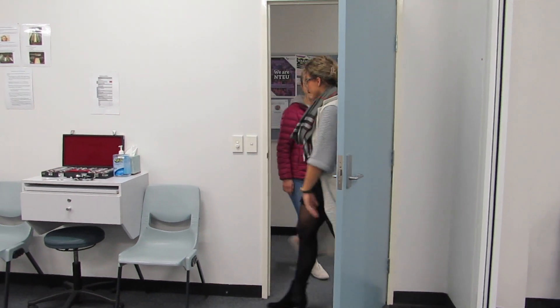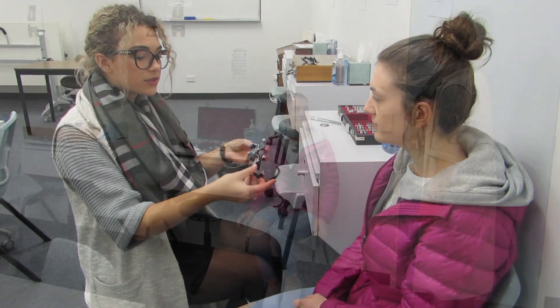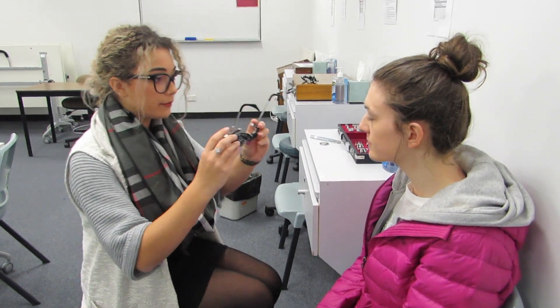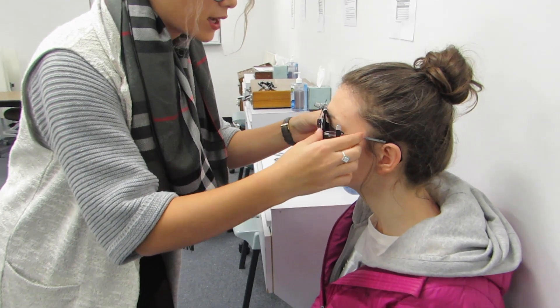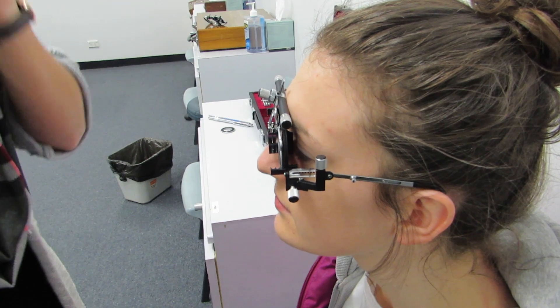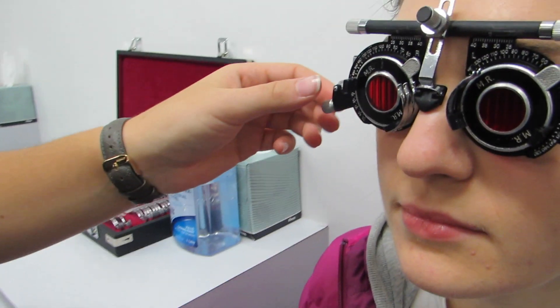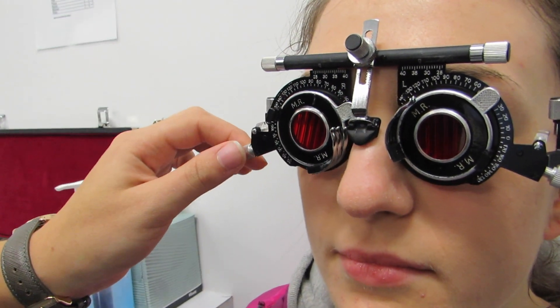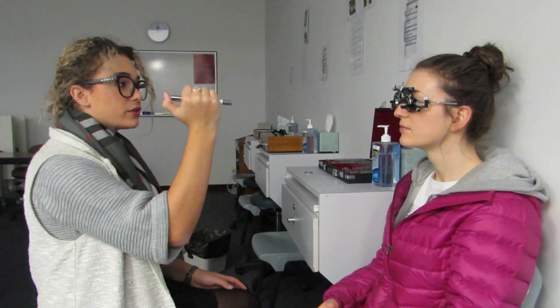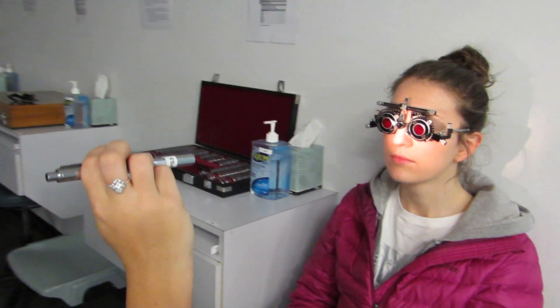The clinician greets the patient and fits the trial frames, adjusting them behind the ears and tightening them. The frames are checked to ensure both lenses are sitting vertically at 90 degrees. The lights are then switched off, and the torch is shone at the bridge of the patient's nose at about one third of a metre, before asking the patient what they can see.